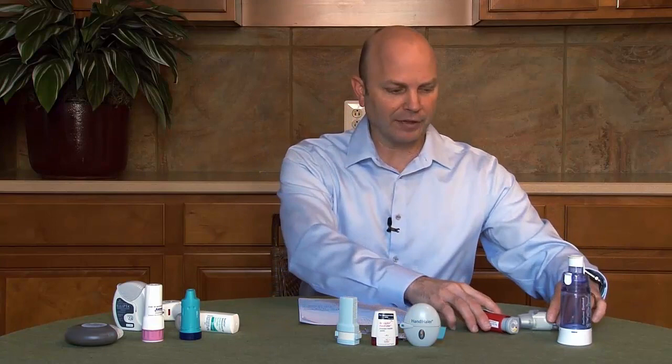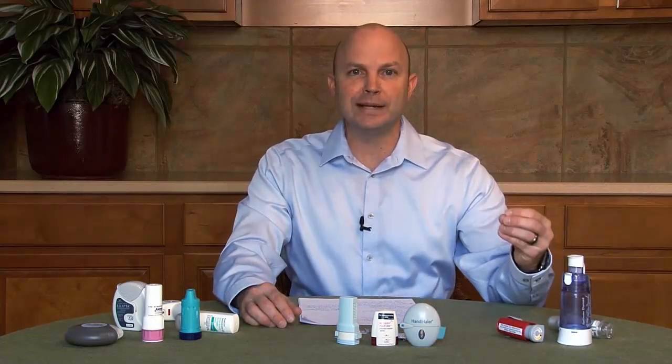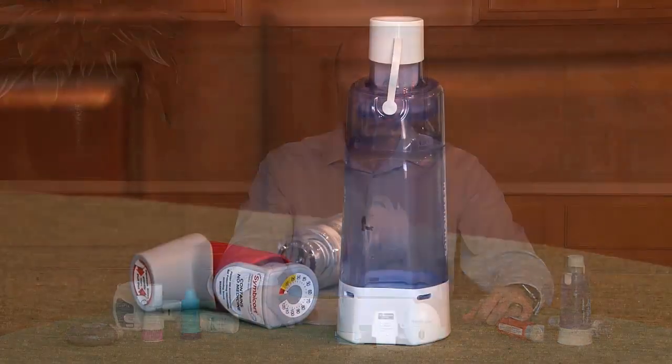Other things to know about the pressurized MDIs is that you want to take a slow, deep breath. This allows the medicine to slowly reach the lowest parts of our lungs where it's deposited where it needs to be.